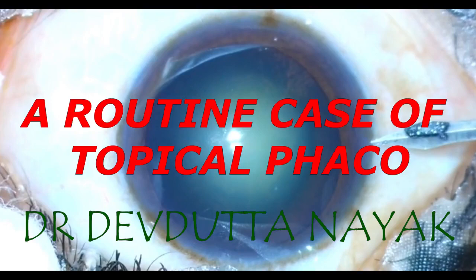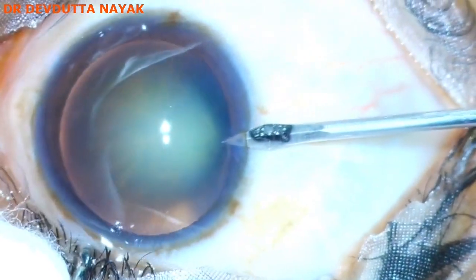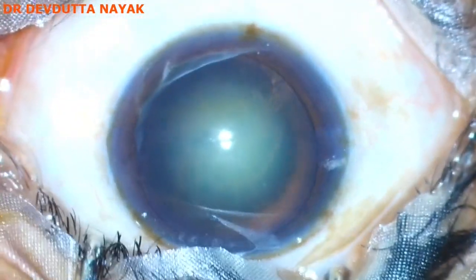This is a routine case of phacoemulsification in a grade 2 plus nucleus cataract.